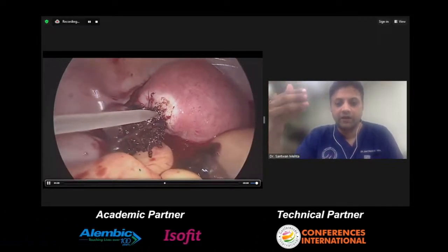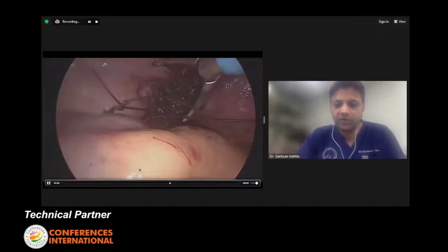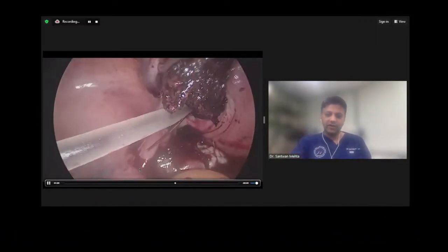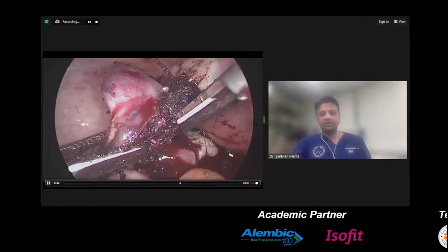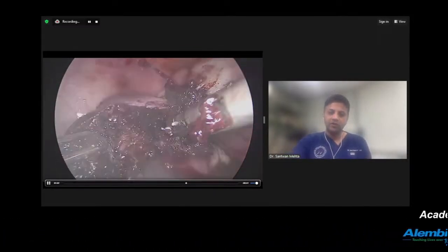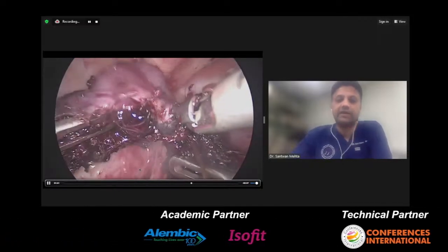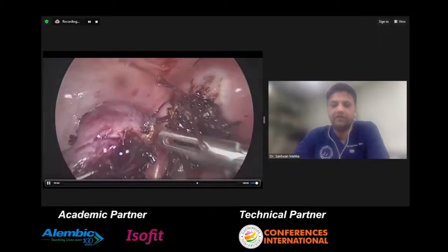For safety purposes, I'll also apply a second loop, so that slowly, gradually, you will appreciate that the bleeding has now reduced. It's almost bloodless now, and once it has cut off its blood supply, I'm removing the ectopic mass very easily without any bleeding. So you can appreciate that it's a very simple technique which serves a good purpose, is easy to learn, and does not take that much time.